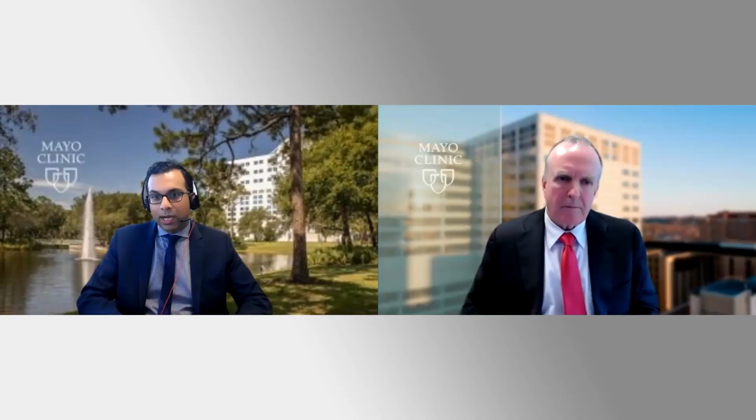Now, the thing that's a little bit harder to figure out is, do we wait until that cardiac MRI is completely normal? And the best evidence for that, again, is from this prospective trial. It's a small number of patients that they looked at because we're only about a year or two out from the initial IL-1 agent trials. So what you notice is patients that have trace pericardial enhancement tend to have a recurrence much later, but they're still having recurrences. So do we wait until this MRI is completely normal before we pull back on therapy? That's left a little bit unanswered, but what I could at least say for sure is if there's a lot of enhancement there on that cardiac MRI, you better be a little careful before you pull back on treatment.